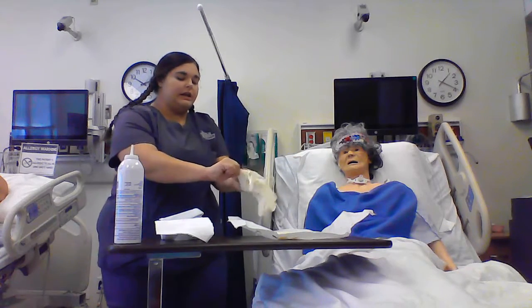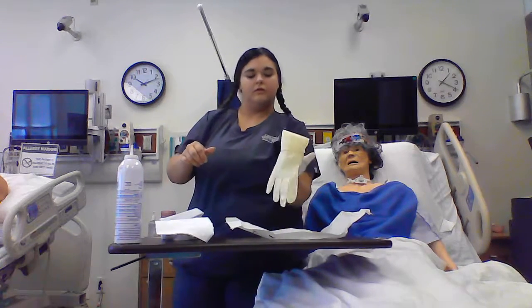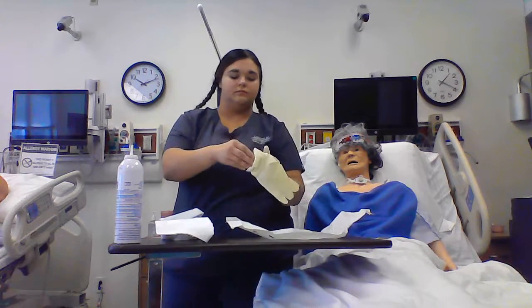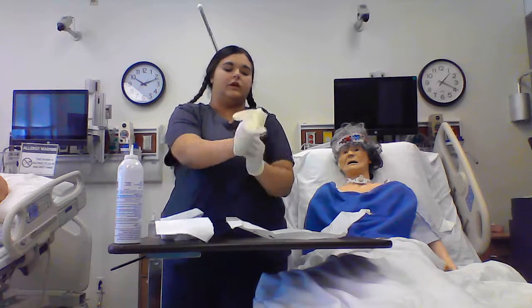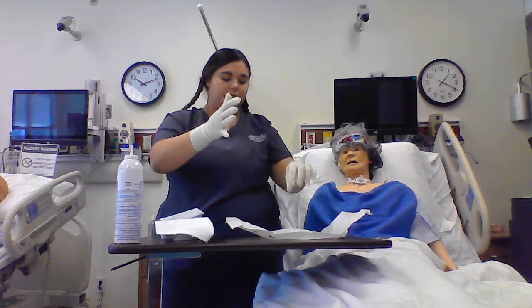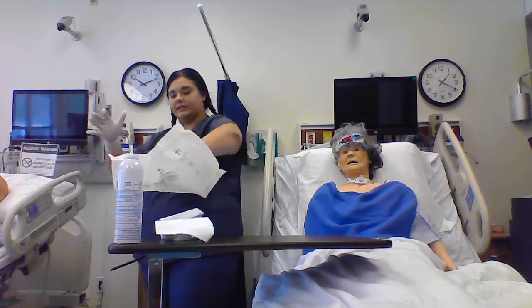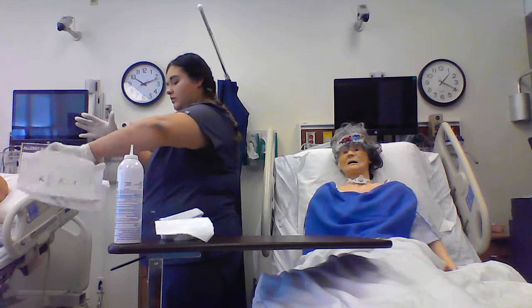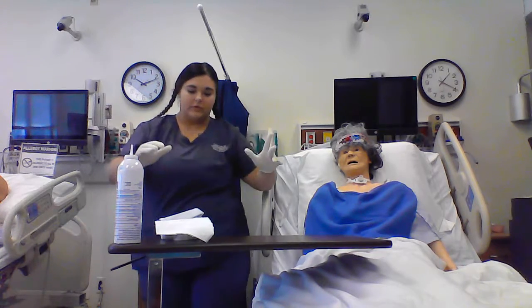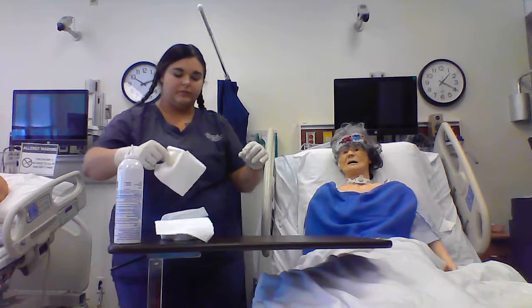On my non-dominant hand first. On my dominant hand second. I'm going to get this out of my way, being very careful not to contaminate my sterile hand. And now I'm ready and I can set up my sterile field.